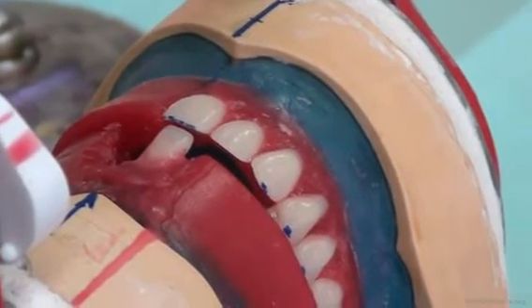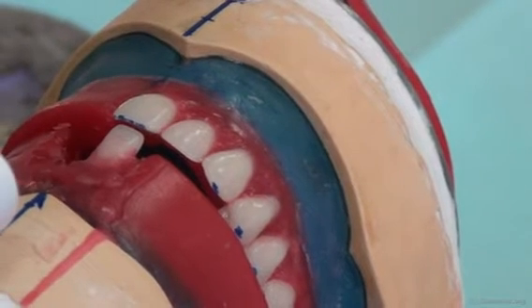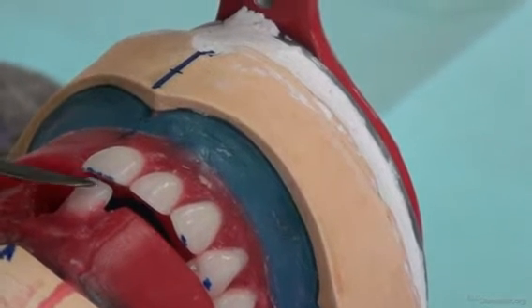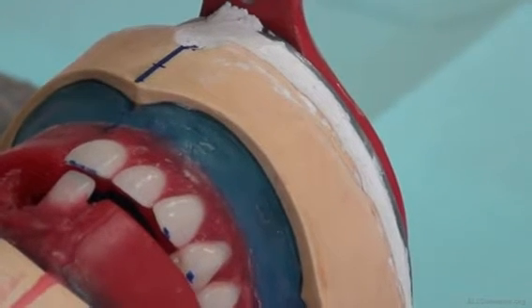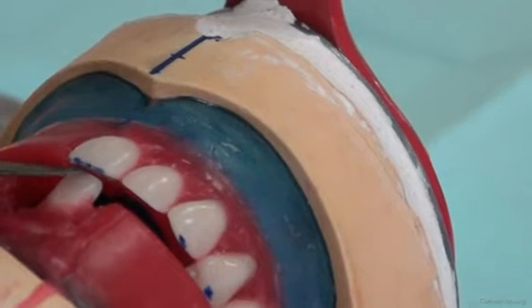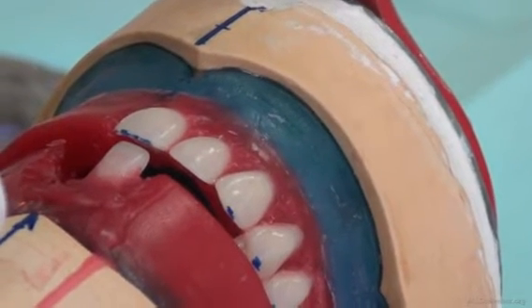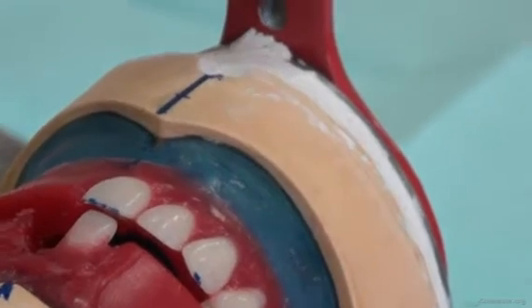Now we're looking more closely at the overjet and overbite. The overjet means that the incisal edge of the lower is more back than the upper incisal edge. And the overbite means that the lower incisal edge is higher than the upper incisal edge and it goes to the inside. But this does not mean they touch. We have an overjet and overbite with an empty space in between these two teeth. We will explain this in the lecture talking about setting rules for anterior teeth.